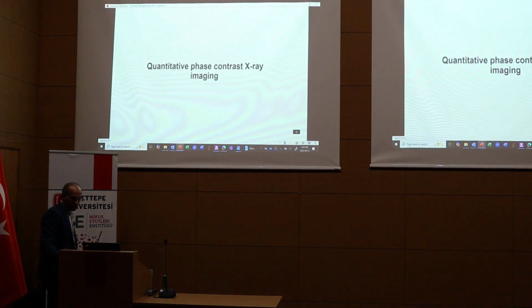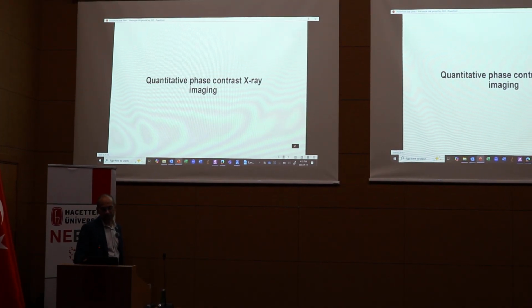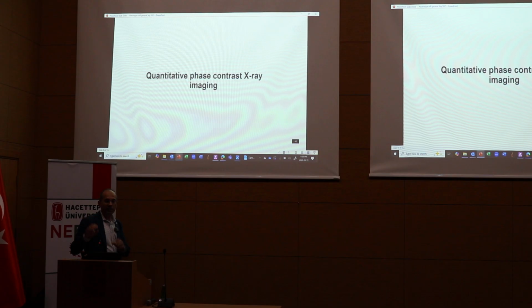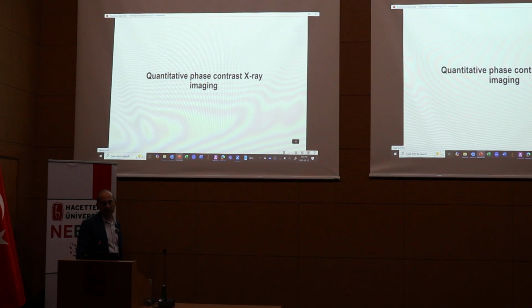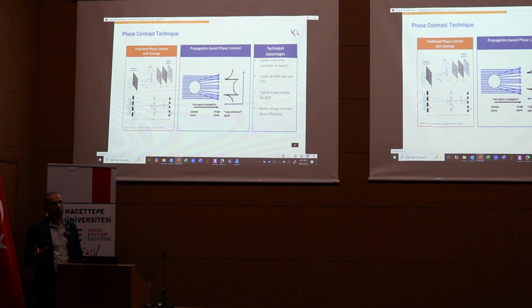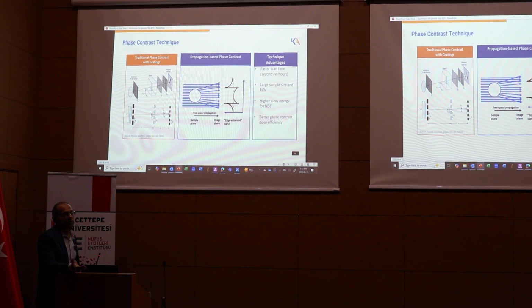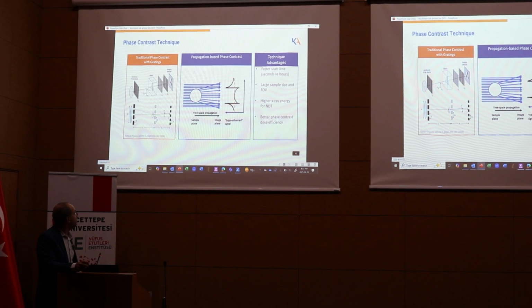Okay, so we talked lots about spectral. Let's switch gears for a second and go to the other imaging that I was mentioning, and this is phase contrast. So what do I mean by phase contrast? Remember I said X-ray, if you think of it as an electromagnetic wave, it has multiple components to it. You've got your amplitude, you've got your phase, you've got a frequency. So phase is what we're going after in this case.